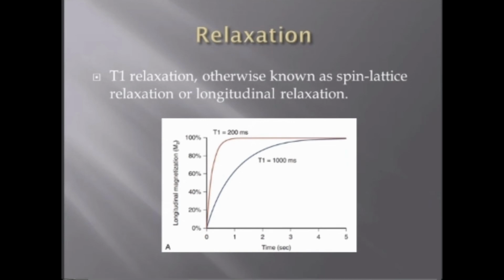Gadolinium-based contrast agents are often injected into the blood pool to shorten the T1 time of blood and or perfused tissues, which, given appropriate pulse sequence settings, can cause a large difference between signals from tissue in the proximity of the contrast agent and the other tissues unaffected by the contrast agent.